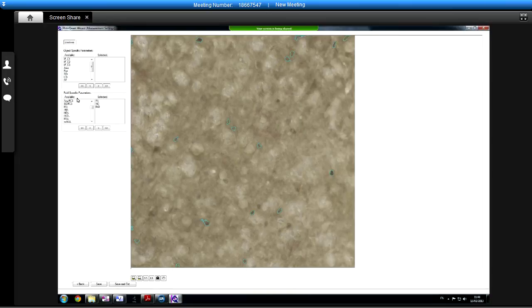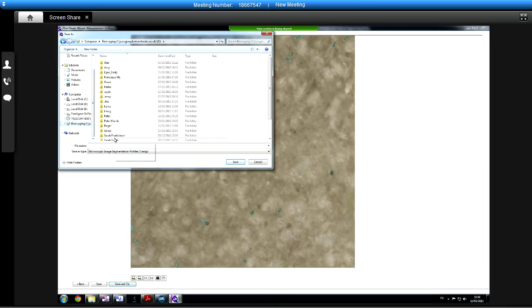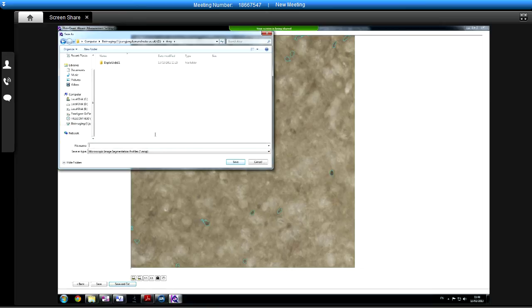So shall I put this in your folder? I've forgotten again. Amy, two people. So shall I just call this? What do you want to call it? Cell count or something? Yeah. Okay, there we go.